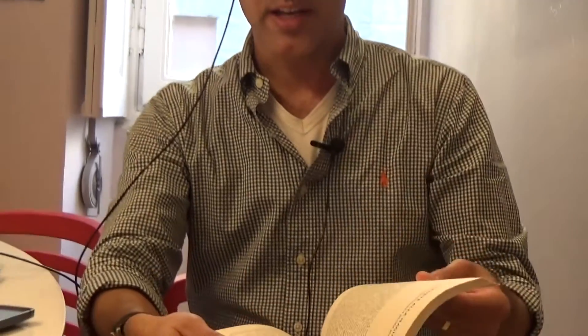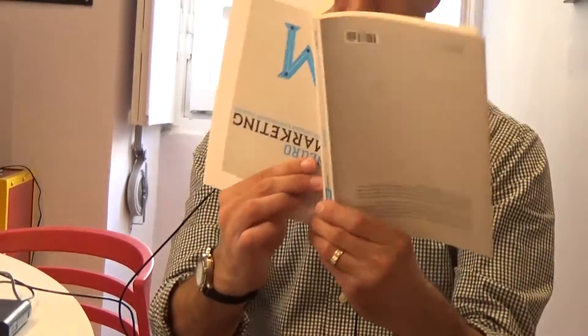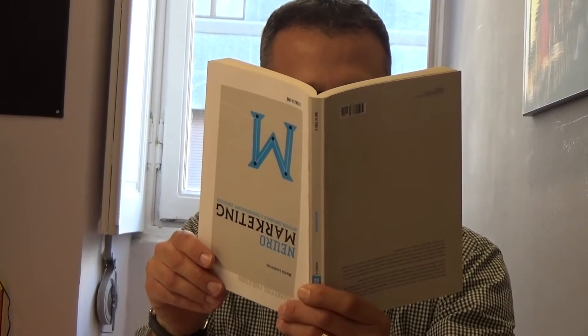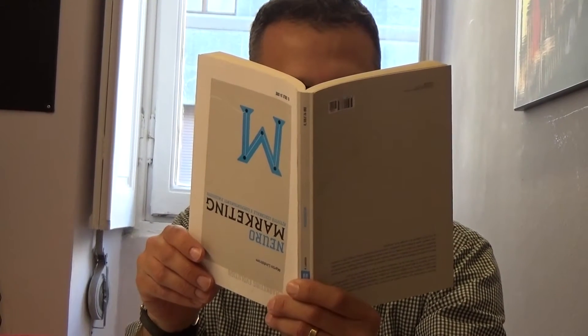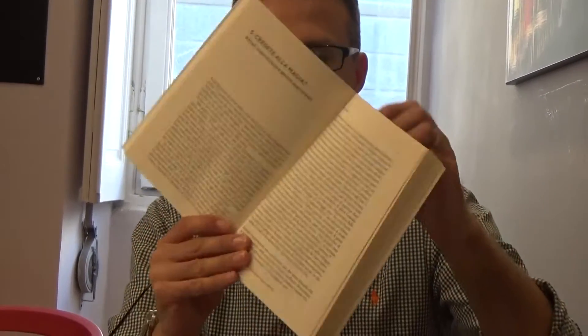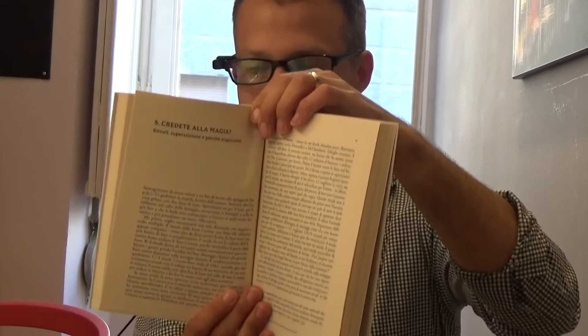OrCam also gives information. If I take the book and turn it upside down and try to read from it, OrCam will tell me the book is upside down. So now I know I have to turn the book to the right side. That's text-to-speech reading.